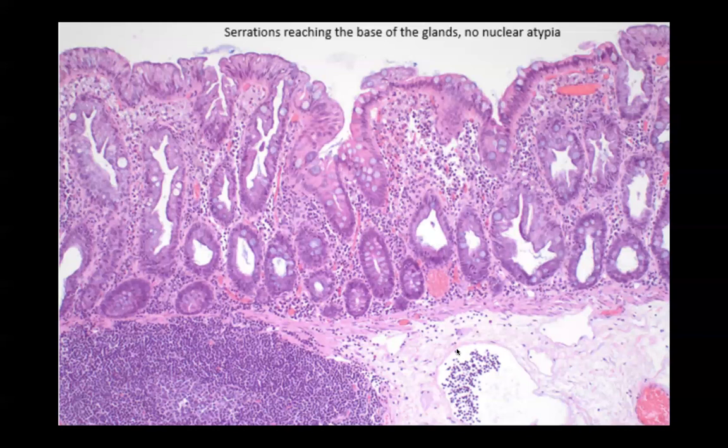May I ask a question? Sure. Thank you very much for this thorough characterization. I'm not a pathologist, so please excuse me if I don't ask the most accurate things. As far as I know, this would be a sessile serrated adenoma without dysplasia. Am I right? Right, absolutely.